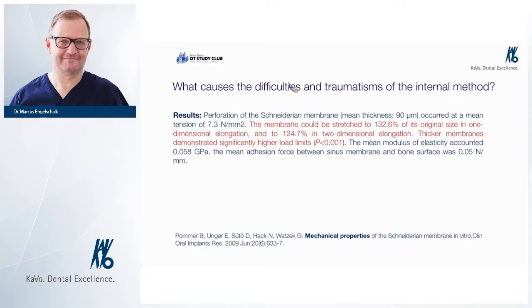You see on the mesial cut, we never cut on the distal side because the blood vessels will come from the distal side and give the flap a little nutrition. So this is very important. Nutrition also plays a big role in creating the flap. So if you see these colored pictures now, you see I marked the flap with a blue line. It's the size of the flap.